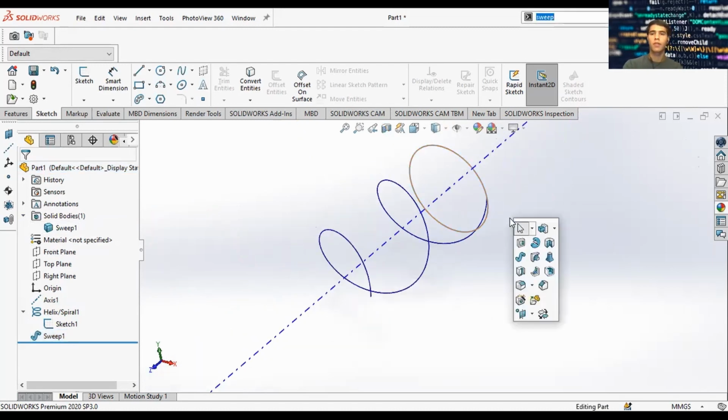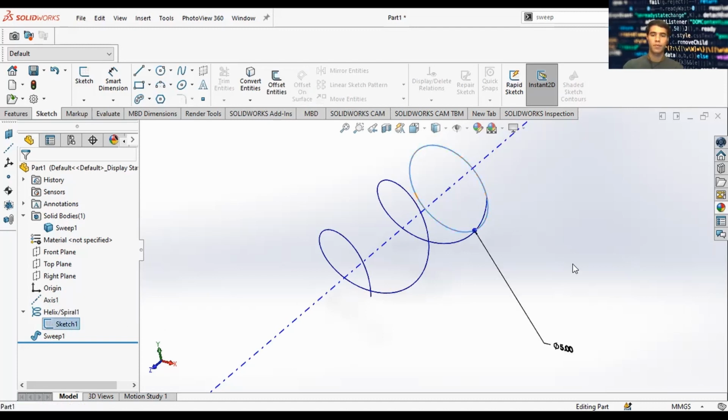So what's next? We're going to add a plane. And the reason we want to add a plane is because right now this helical spiral is attributed to this circle. So we can't make another helix spiral because it's already based off this circle that we did on sketch 1. We're going to add a different plane so we can add that extra circle. So we'll go here to plane, to search plane.